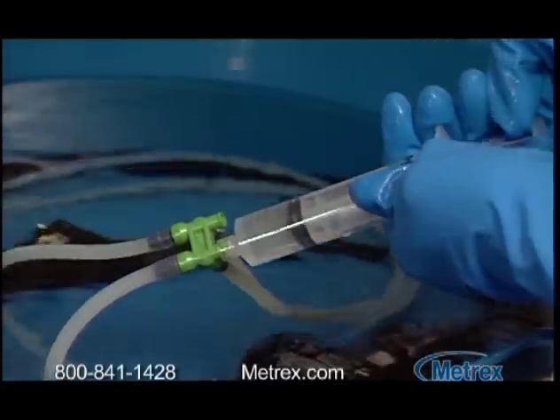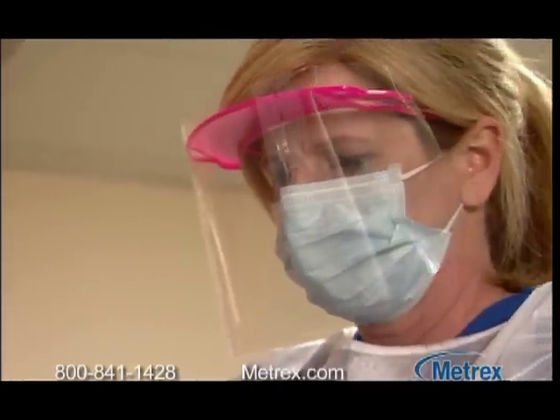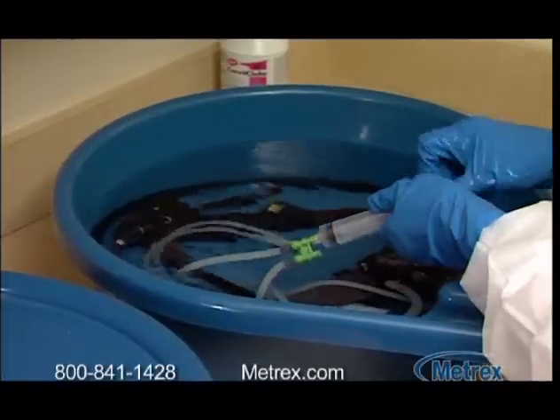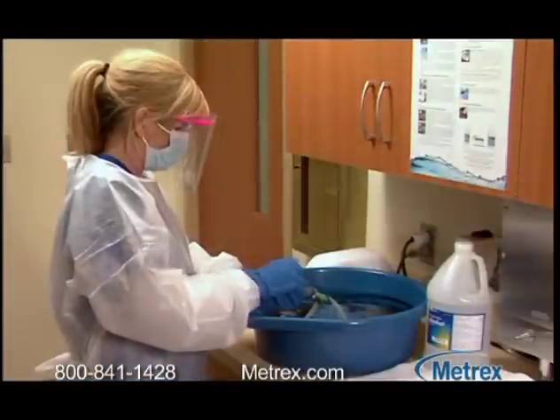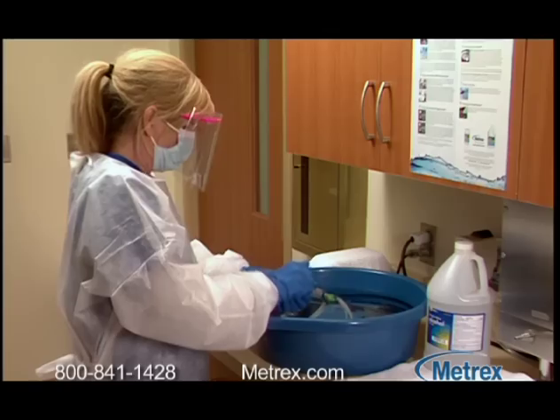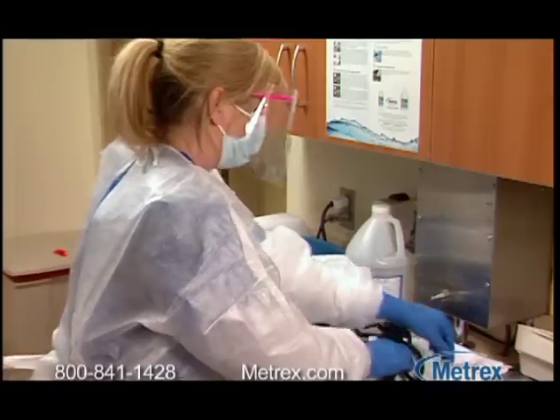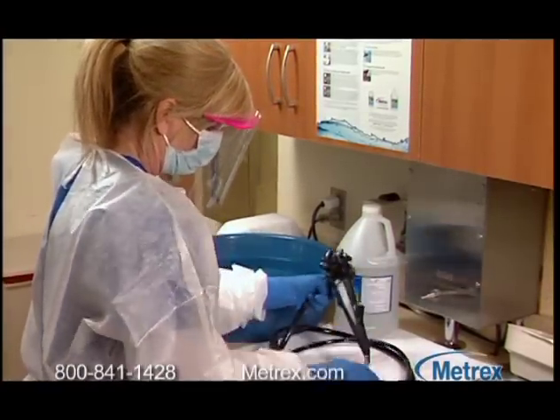This will reduce the chemical residue to safe levels. Remove the device and discard the rinse water. Repeat the rinsing procedure two additional times for a total of three rinses, using at least nine liters of fresh water every time. Some devices may require a rinse with 70 to 90 percent isopropyl or ethyl alcohol to facilitate drying. Dry the exterior using a clean lint-free cloth and either air dry or use medical grade air according to manufacturer's instructions.